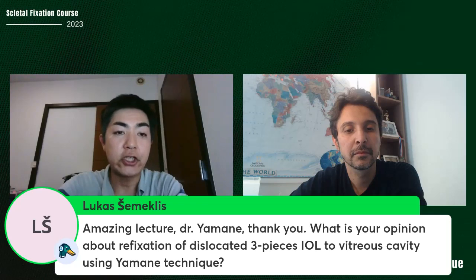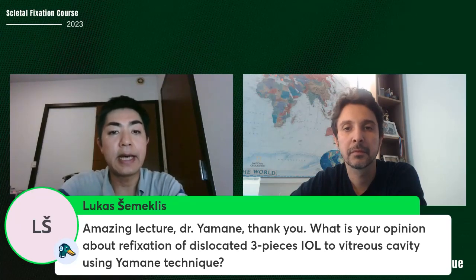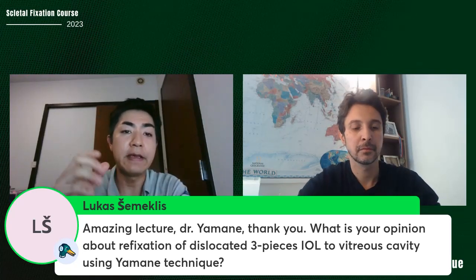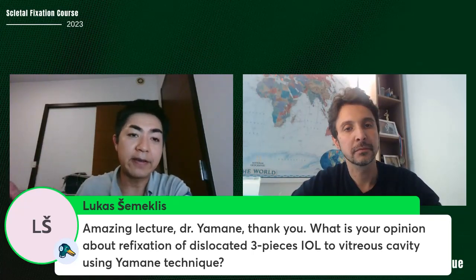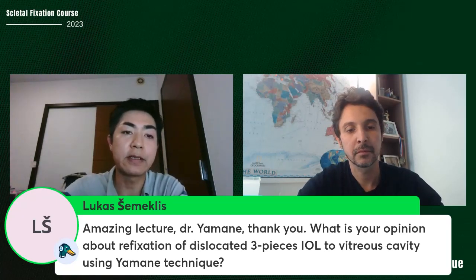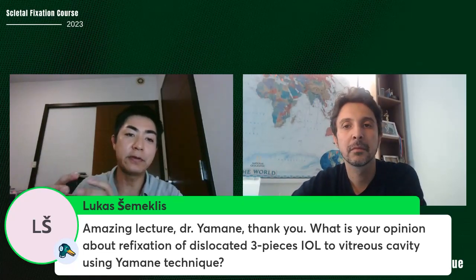Yeah, regarding reusing the IOL, I tried some cases, but I stopped reusing the dislocated IOL because the IOL always deforms if it is fixed in the back. If the dislocated IOL is fixed in the sulcus position, you can use the IOL. But if the dislocated IOL is inside the capsular bag, you should remove it.